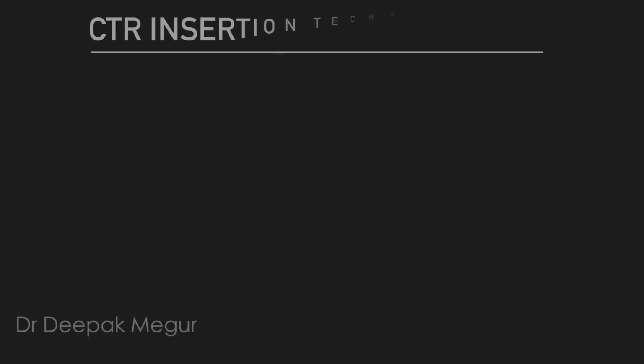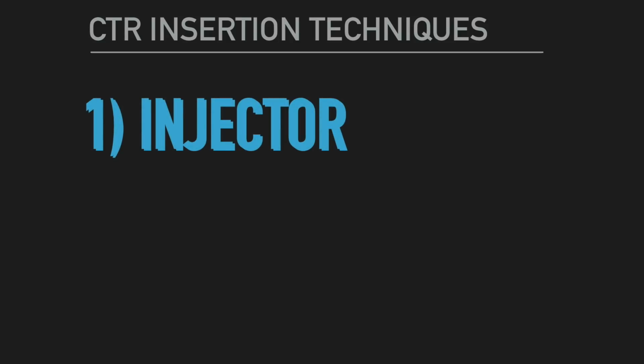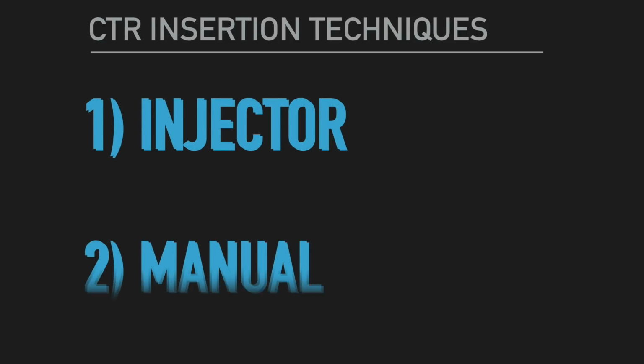Now moving on to the insertion techniques. We have two methodologies by which we can introduce a CTR. The first one is using an injector and the second one is manual.